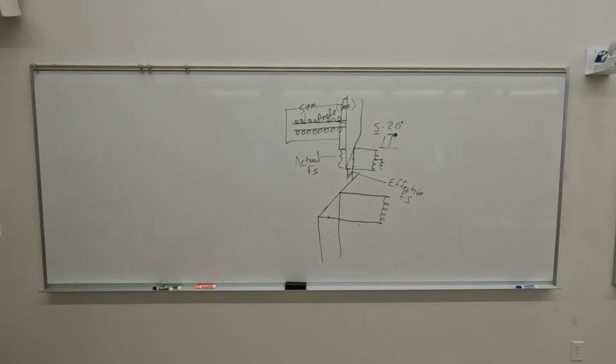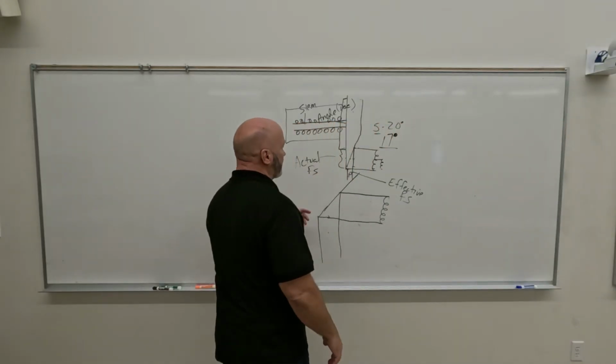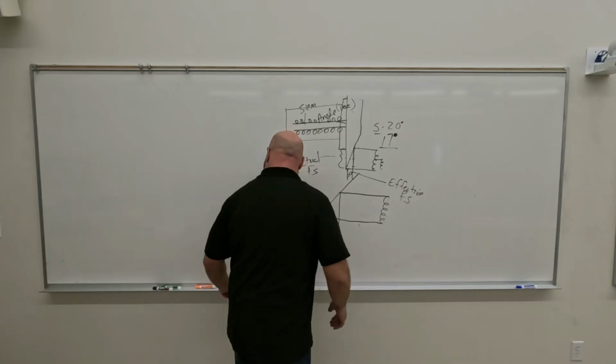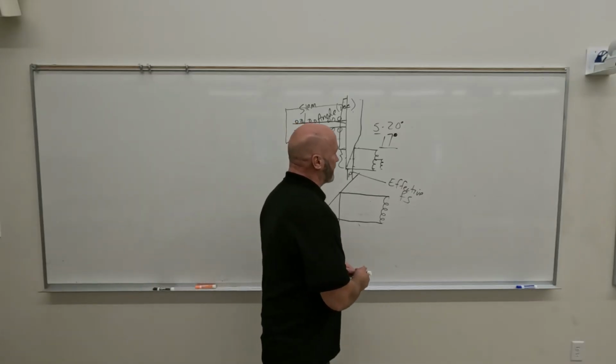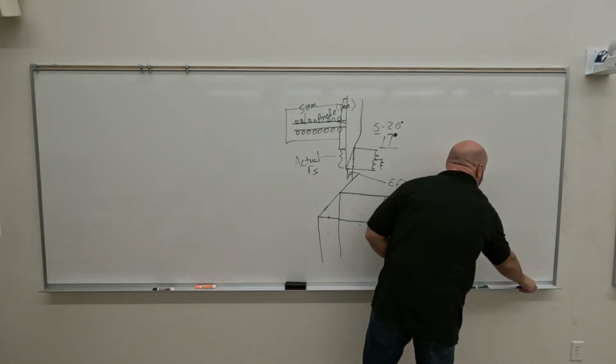It makes it sound like it's an engineering marvel that they did this thing. And it's really not. It's the only way we could make the X-ray tube.